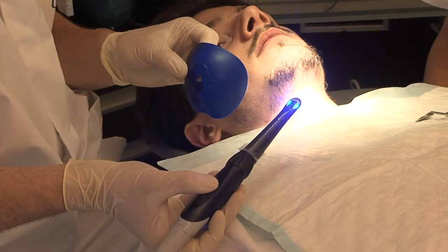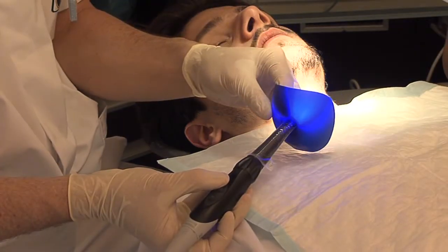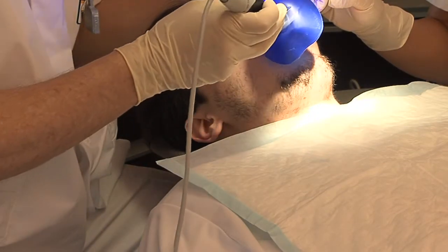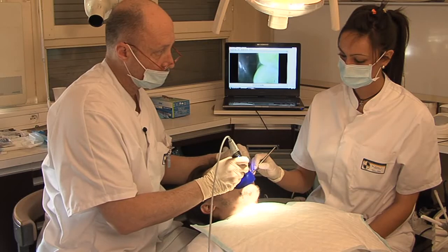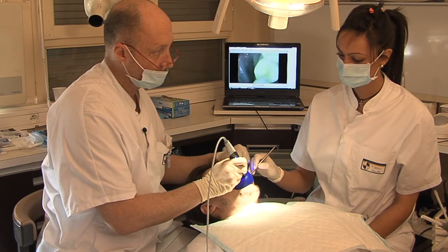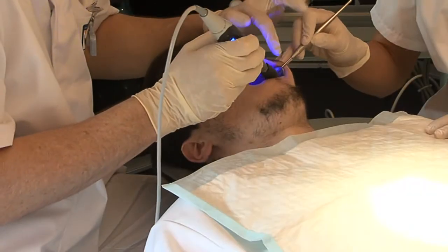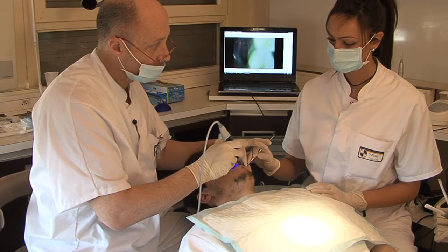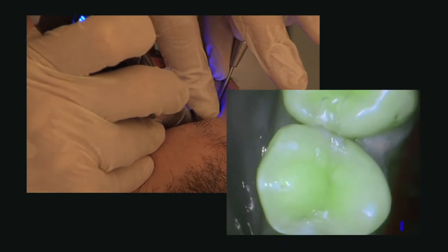A light shield to block out external daylight is available so you don't even have to move the dental light. Using Soprolife in the diagnosis mode is child's play, since the information collected can be used straight away.